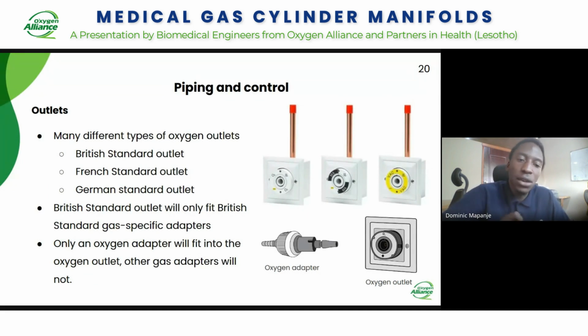Also, an oxygen adapter will only fit into an oxygen outlet. A British standard oxygen adapter will fit into a British standard oxygen outlet. A British standard medical air adapter will not fit into a British standard oxygen outlet. So oxygen adapter, oxygen outlet; British standard adapter, British standard outlet.